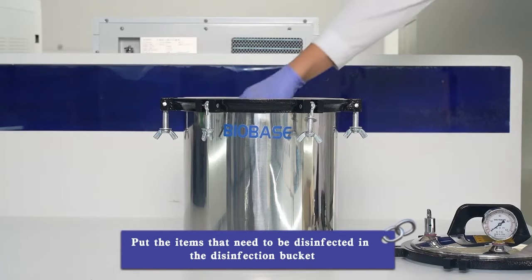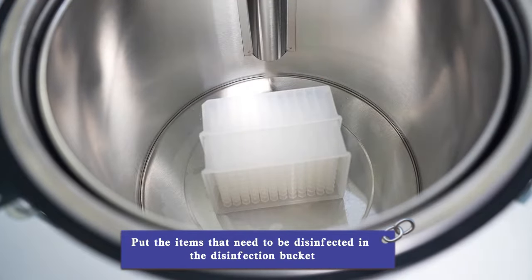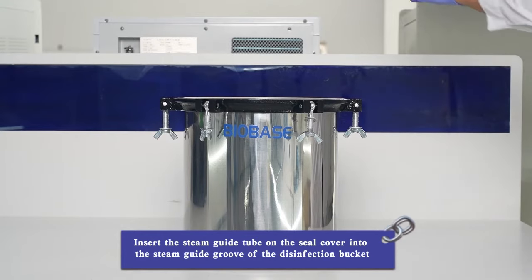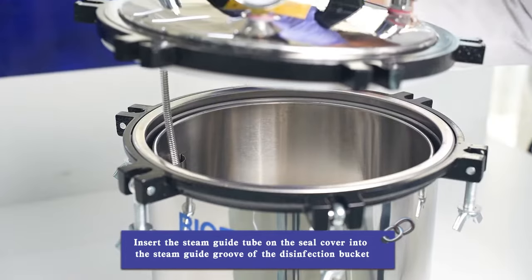Put the items that need to be disinfected in the disinfection bucket. Insert the steam guide tube on the seal cover into the steam guide groove of the disinfection bucket.